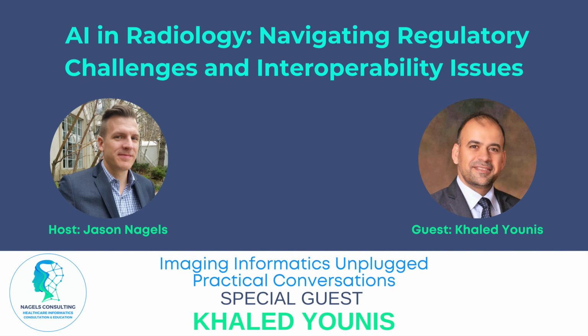But as I said, still we have to look into other regulatory as well as other barriers to what is really needed. So currently there is a need for strict clinical validation, and that makes it very expensive to go through the clinical validation for products in AI that requires regulatory approval. The other issue is interoperability. And you know that there are many systems in the radiology department and the healthcare industry that need to talk to each other.